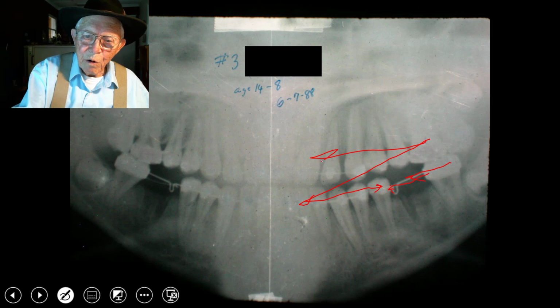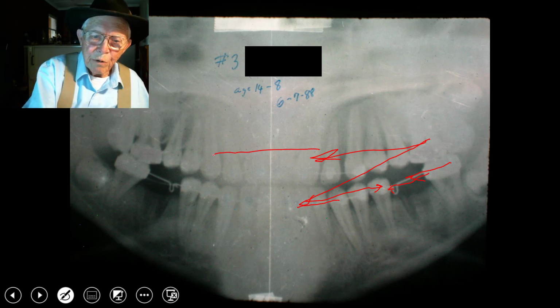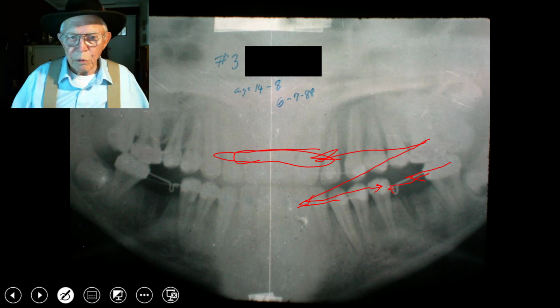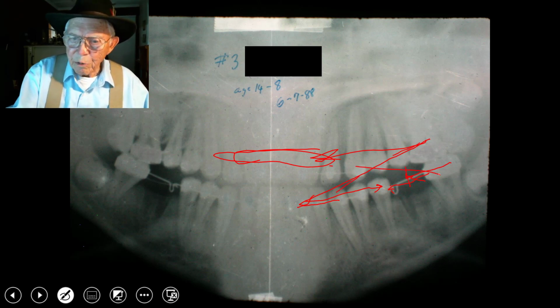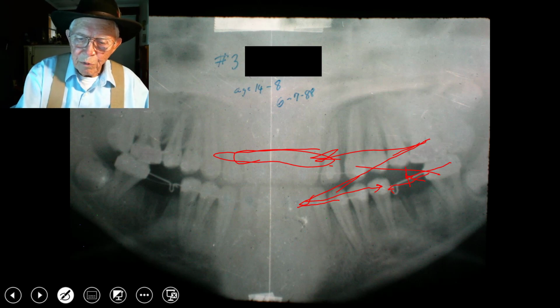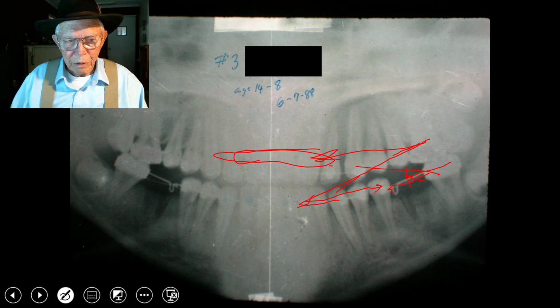These teeth will be pulled forward as we pull this whole thing backwards too. So these teeth will be in a further forward position when you get through this case. And the teeth down here on the bottom will close up till you get to a good class 1 relation, and then you regulate the elastic. You work with it here to regulate exactly where you put those lower teeth. In other words, put them exactly right on the spot you want.